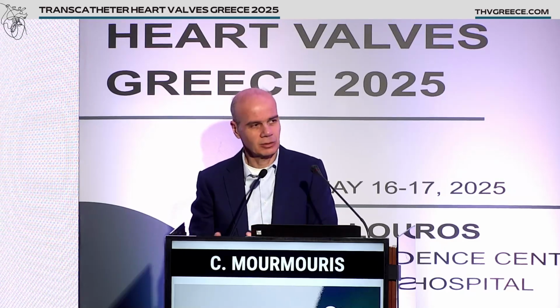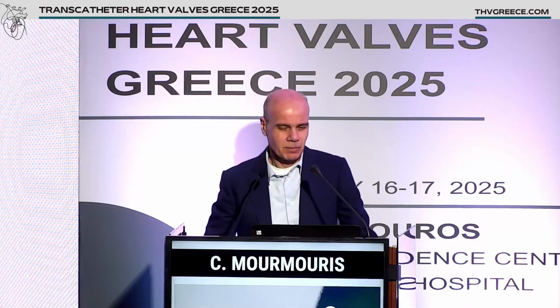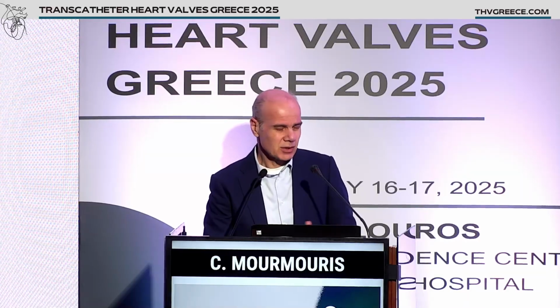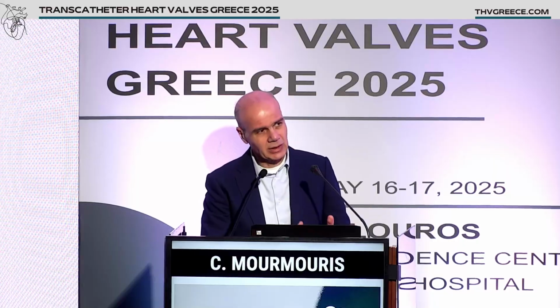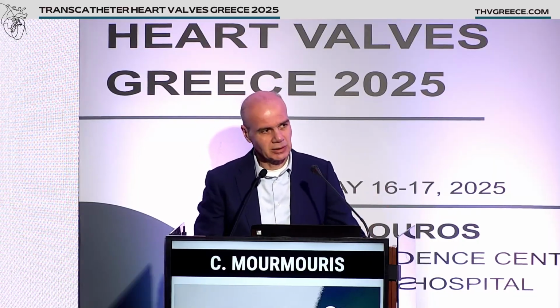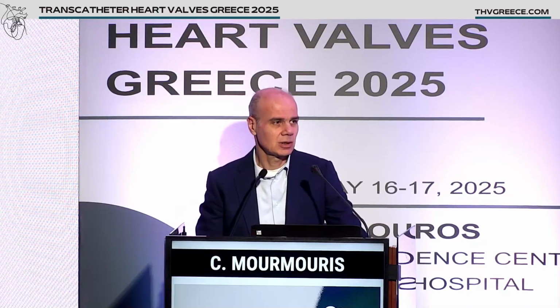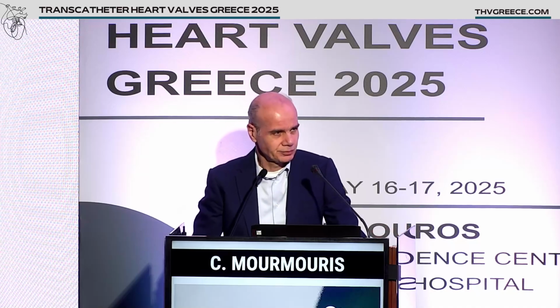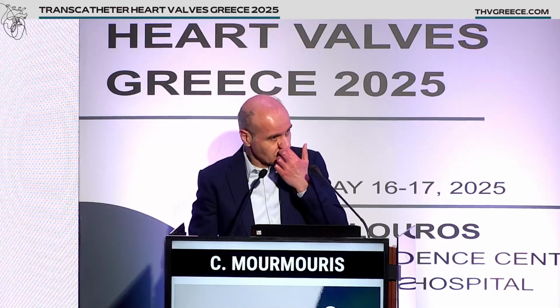TAVI wants left chambers only. Another difference is that in TAVI we target the arterial route, and in tricuspid valve we target the venous system. The contrast protocol is not the same.